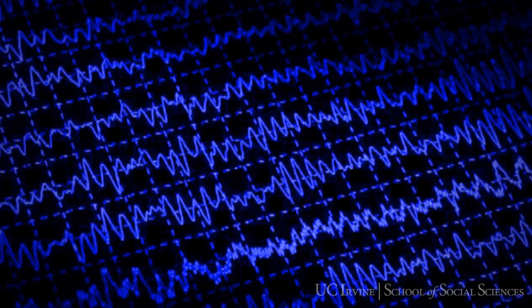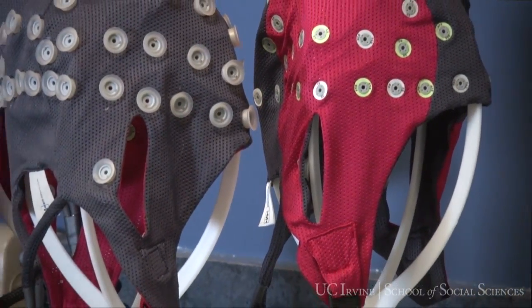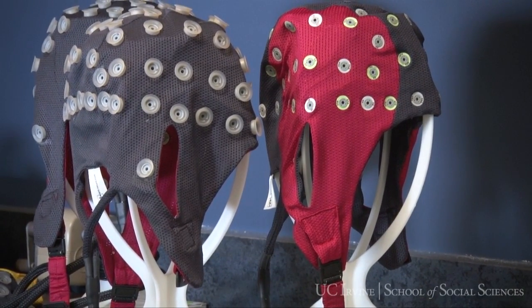Different mental activities generate different brainwaves. We use EEG to measure brainwaves and send them to a computer for processing. Brain-computer interface software on the computer works by analyzing signal strength at different frequencies at different locations on the scalp. The results of this analysis are used to determine which commands to send to the robot. The brain-computer interface uses the direction in which the user is attending to indicate to the robot which way it should turn.